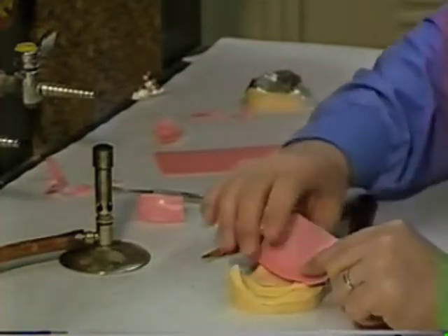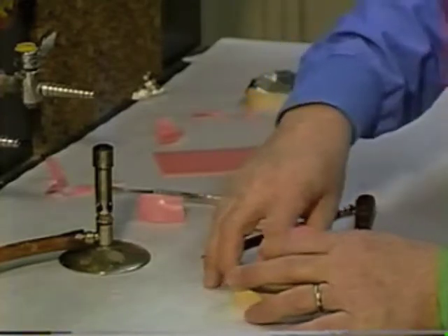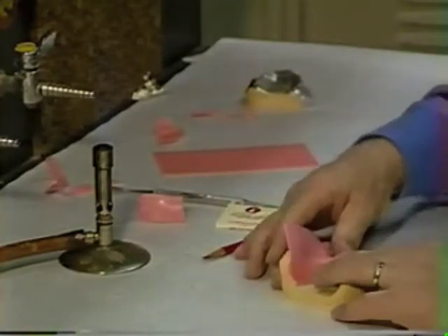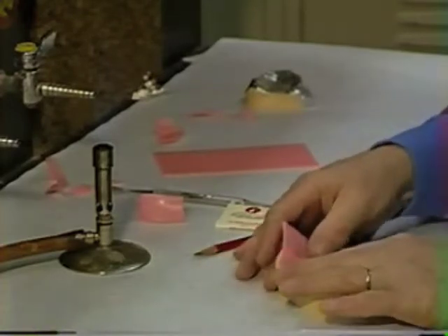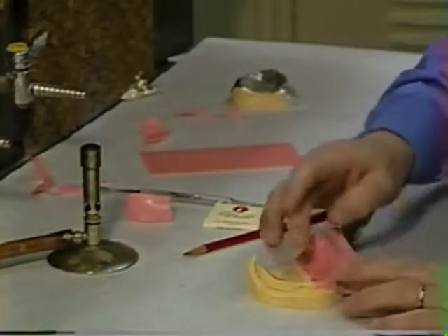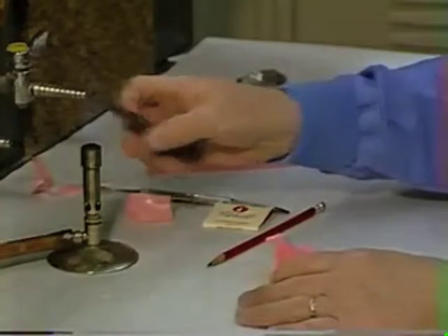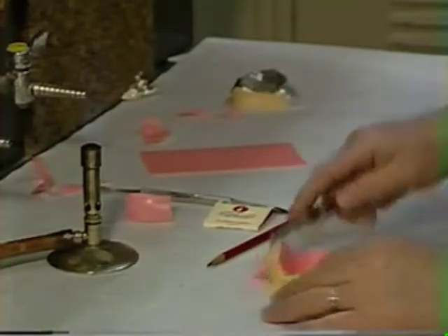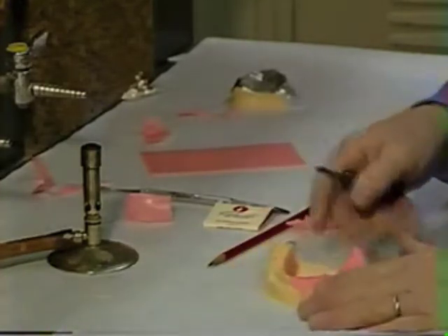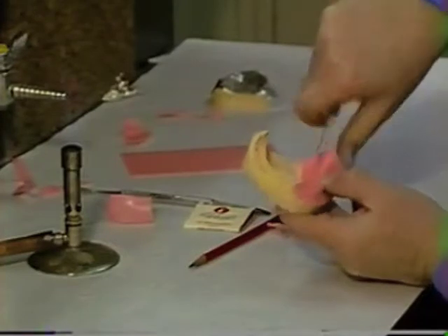and adapt it generally to, I usually start on the lingual with it and adapt it well down into the mucolingual fold area and over the crest of the ridge and adapt it well to the cast. And take a knife, get rid of the excess. We can do the same on the lingual, we're getting rid of the excess. Just take a knife and cut it off of there.